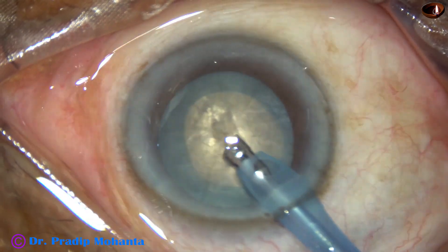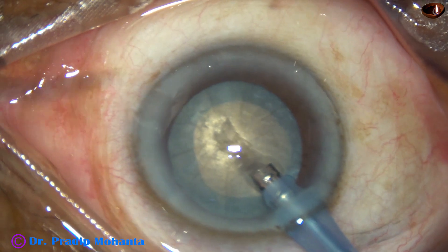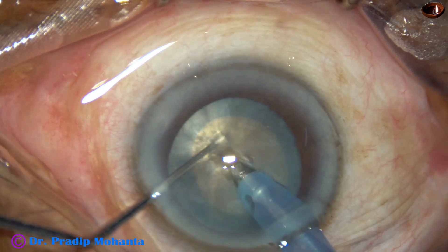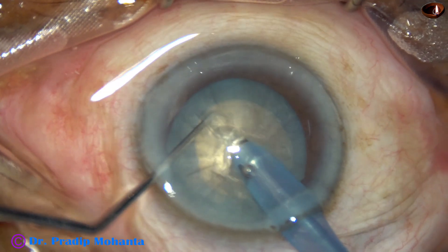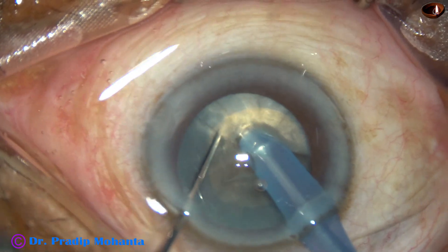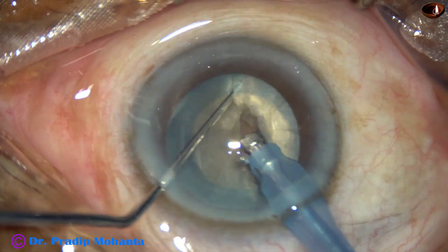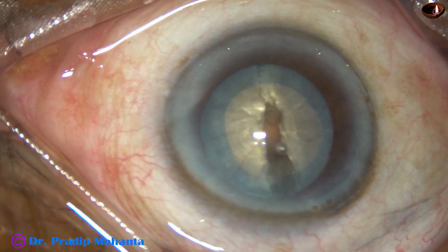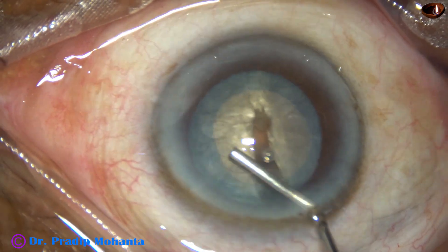I make the tunnel and go through it. I go through the substance of the nucleus and try my technique, Submarine Chomp. It is a very hard, leathery nucleus, and I found it very difficult to manage this nucleus with this size of rhexis.